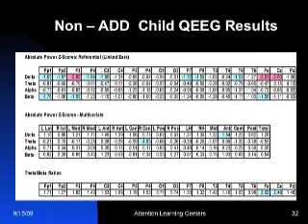Let me show you what we get. What we get, first of all, is statistics on the brain. So the Q in the EEG means quantitative. We do statistics. So this is a child, because people always say, what does a child kind of normally look like? This is a child who didn't have ADD, whose parents thought they did. He actually had a lot of motivation problems, and the parents had totally different parenting techniques, and there was a lot of stuff going on at home.